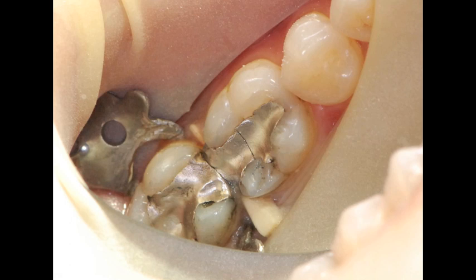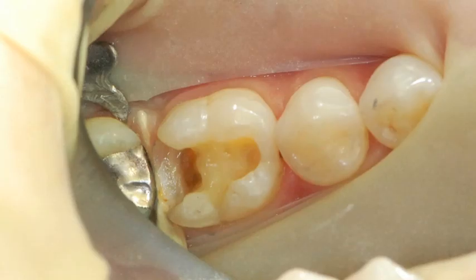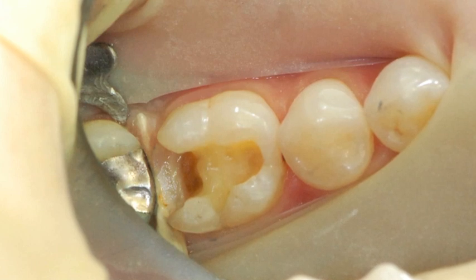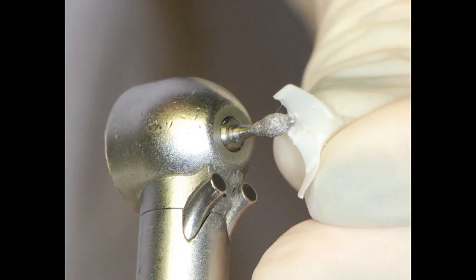Now I'd like to show you how to apply this to everyday dentistry. This patient presented with a failed, fractured amalgam in tooth number 30, the lower right first molar. The radiograph confirmed recurrent decay directly under the fracture, and the patient requested a white tooth-colored filling material. Once the old filling was removed, there was a moderately large box that needed to be filled, and utilizing a separating ring would be difficult if not impossible.